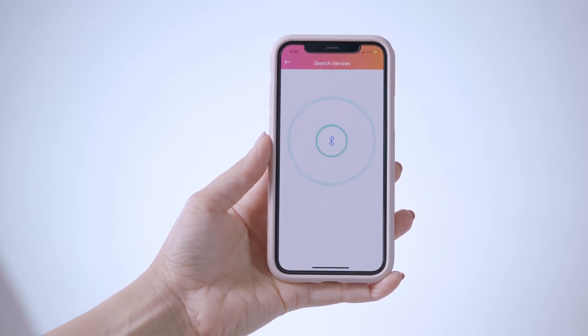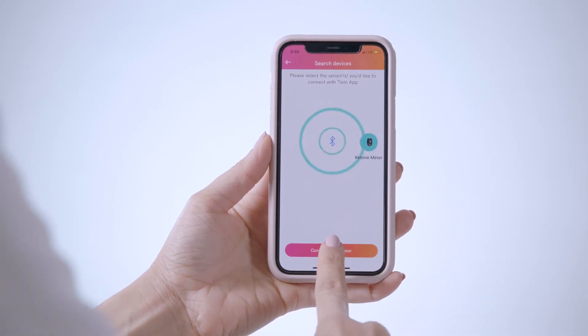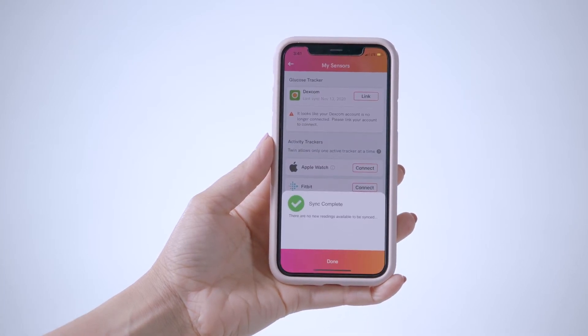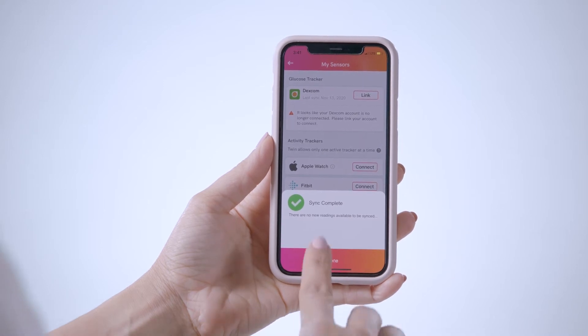In the Twin app you will see a ketone meter sensor icon appear. You will tap this icon and then tap Connect with Sensor. At this time, you will leave your app open and make sure it is near the meter. A message will appear to say the sync is complete — press Done.